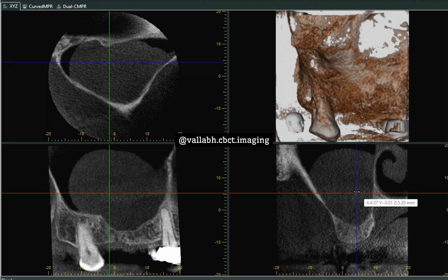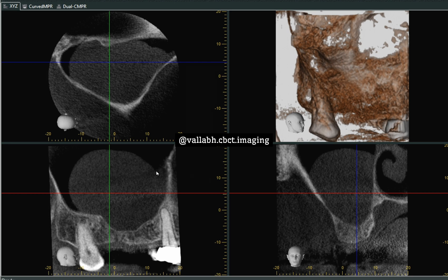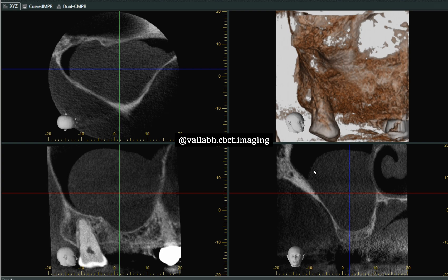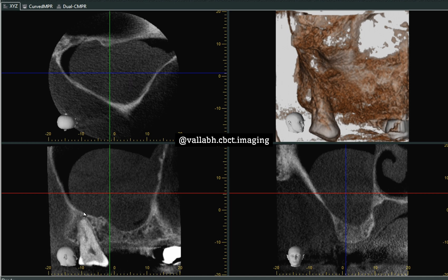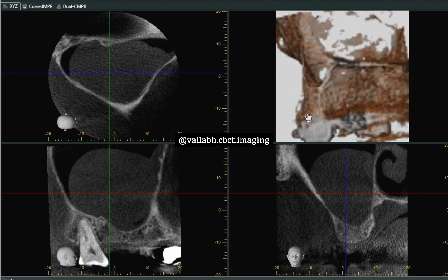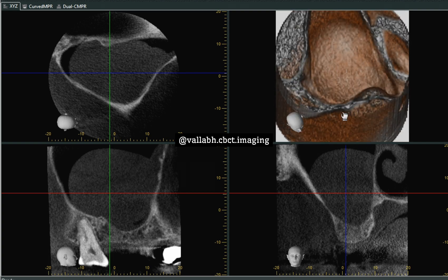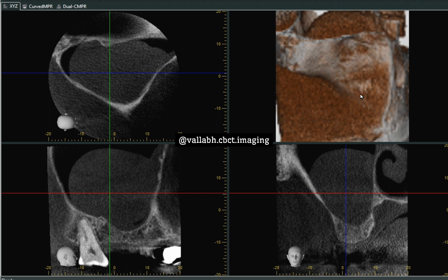They usually appear as smooth, round, outward convex borders and are nothing but soft tissue masses, less likely to be fluid-filled masses. They appear attached to the antral or sinus mucosal sinus wall. This is how it appears in the axial section, the same in the sagittal section, and the same in the coronal section. They are less likely to be seen in the 3D volume images because it is a soft tissue mass.